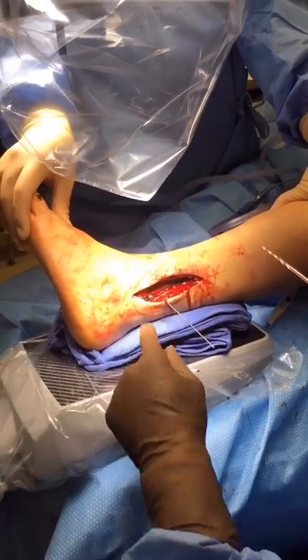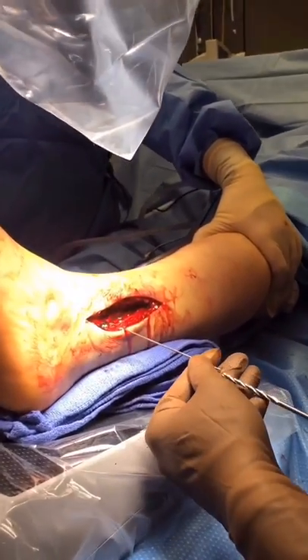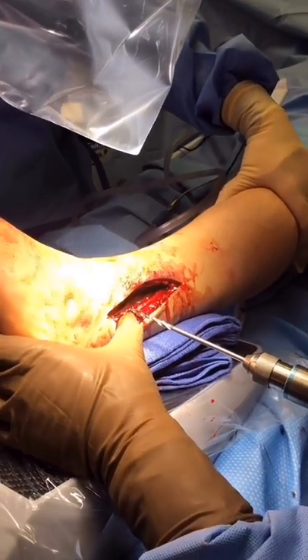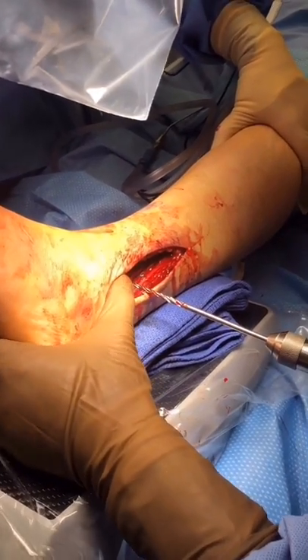This is the intraoperative view. You can see the fibular plate and the K-wire. Next, the step drill from the kit was introduced over the K-wire, and the fibula and tibia were drilled with the step drill.